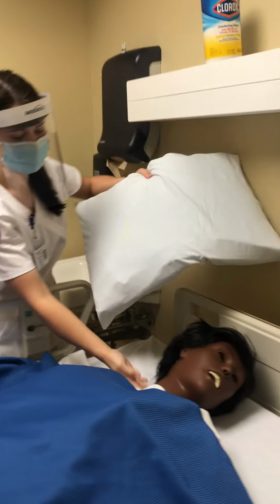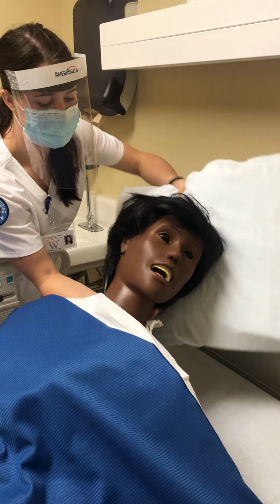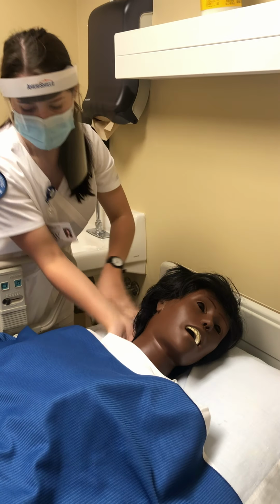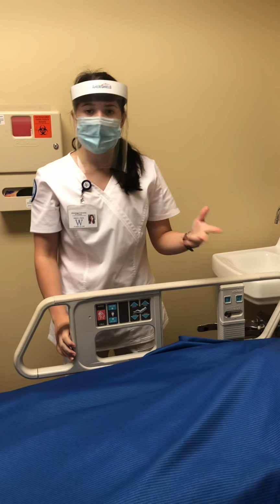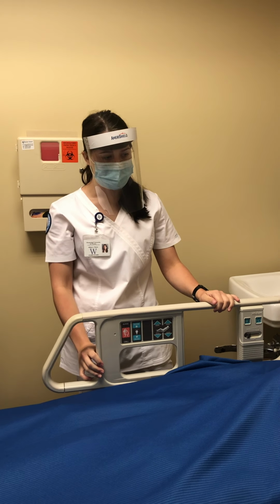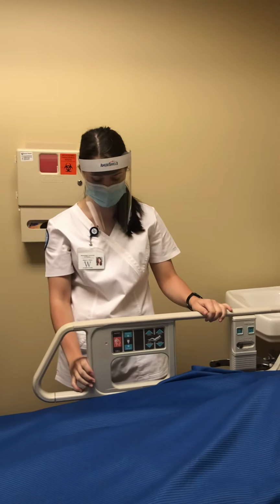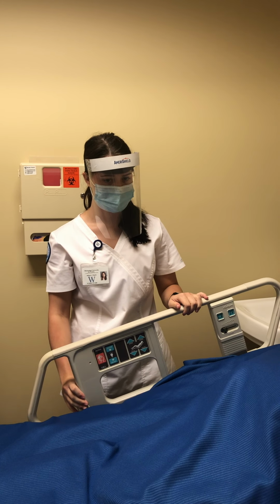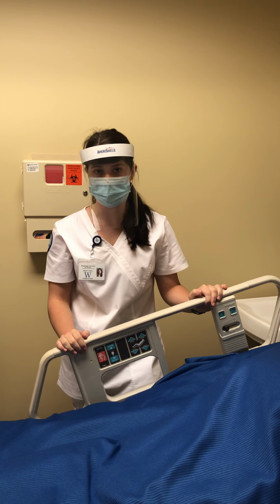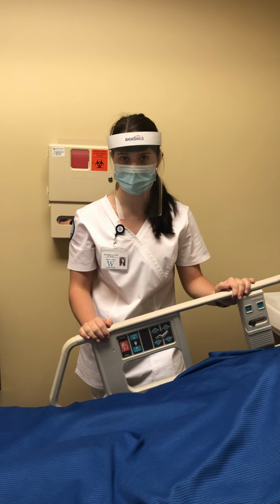Again, supporting the head and neck area, placing the patient back in position. If the patient requests to be lifted up, you can go ahead and raise their head, making sure that they are comfortable. That was good.